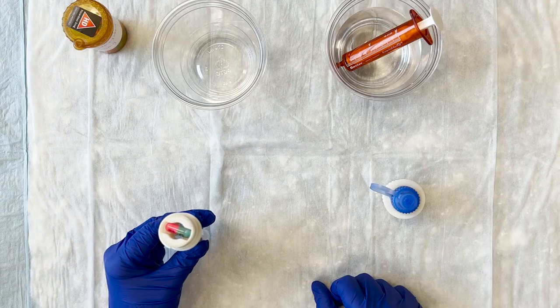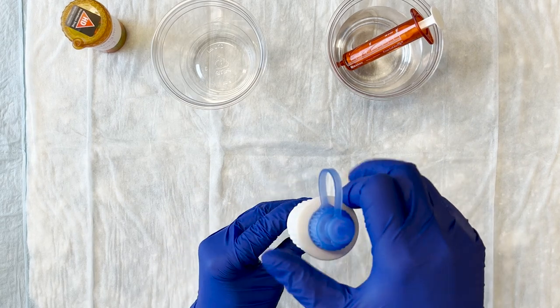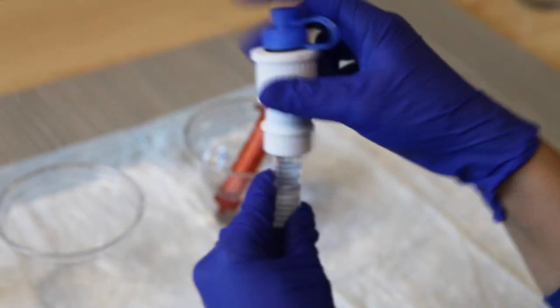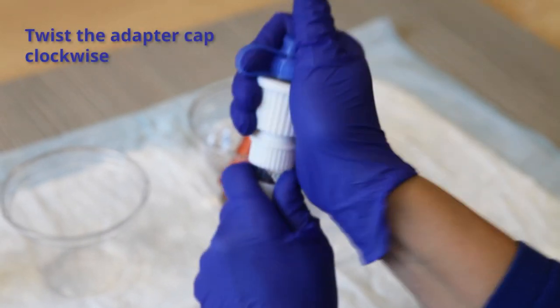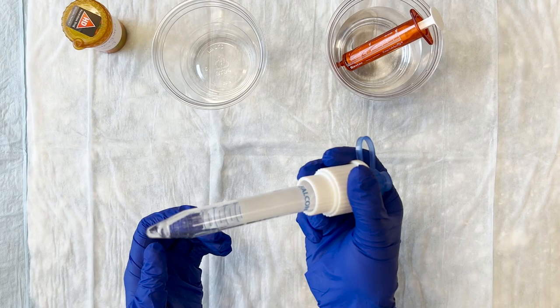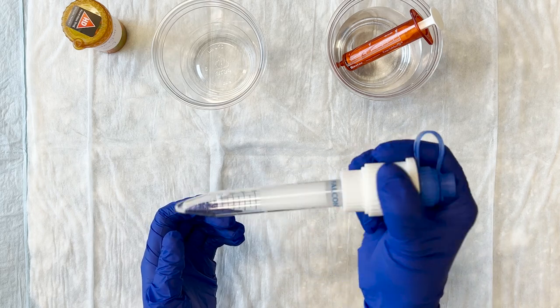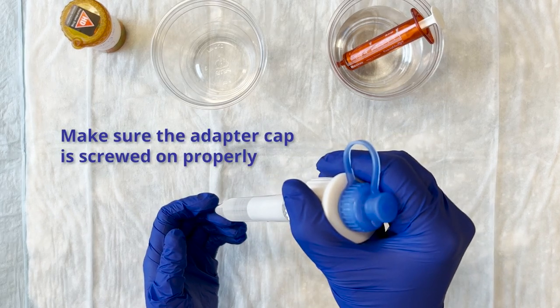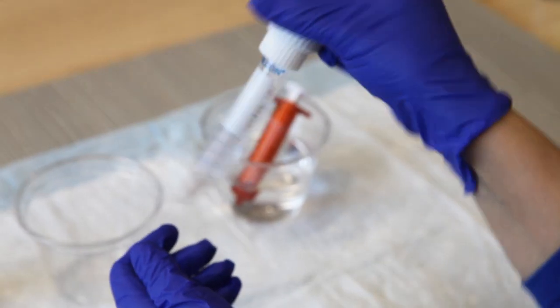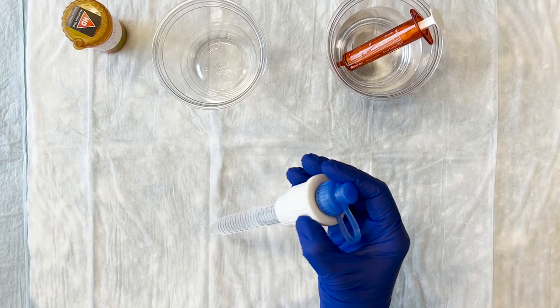Once the capsule is lying in the hole, screw the capsule shredder adapter cap on clockwise onto the adapter body. Use the adapter cap to shred the capsule by twisting it clockwise — you will hear a grinding sound. The contents of the capsule will fall into the water and dissolve. Make sure the adapter cap is still screwed on properly, then gently rock the device back and forth to help the medication dissolve.